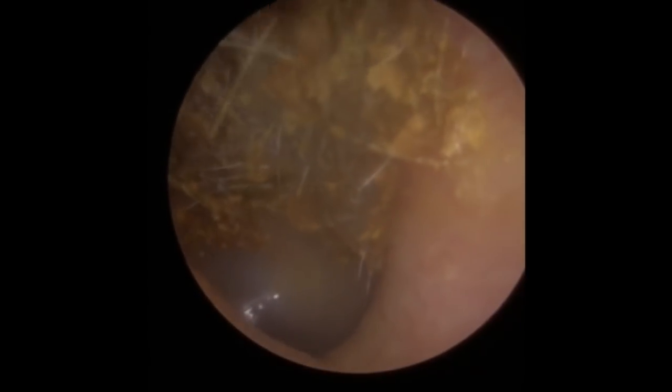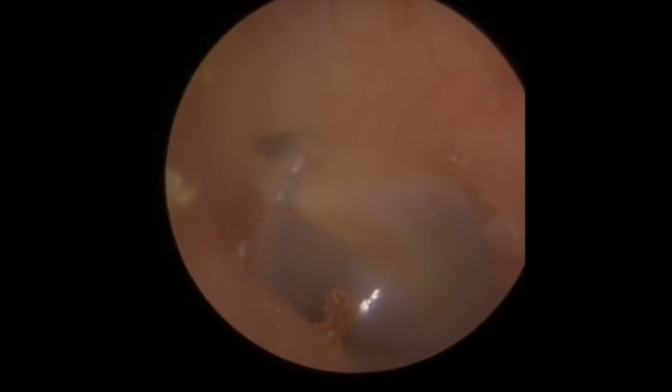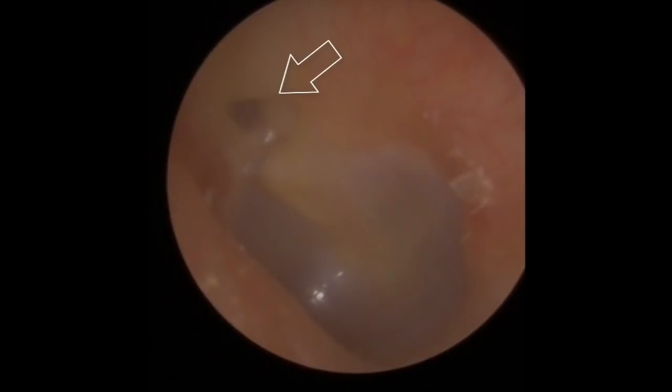The bottom section's gone — we've just got to clear the top section now. I want to take a look at the attic region on this one as well, just because the patient has a retraction pocket on the other side, so it's definitely worth taking a look. There's the eardrum, with a little tiny bit of wax jutting out on the canal wall — we'll just go ahead and grab that. Not going to cause any problems but we'll get rid of it. So there's a retraction pocket on this side too, not as pronounced as the other side, but nice and clean. And the eardrum looks lovely and healthy.